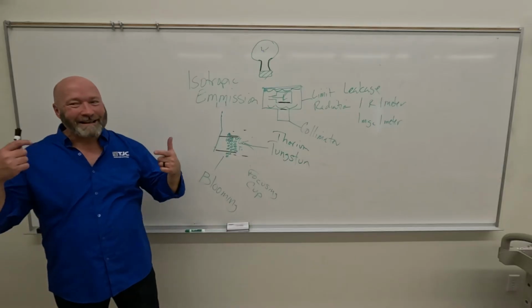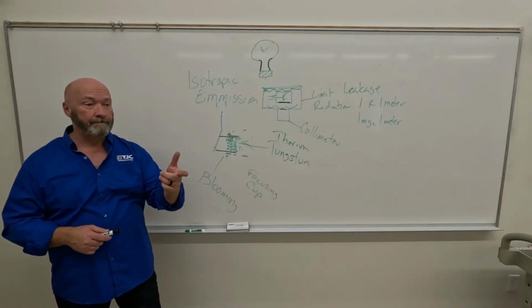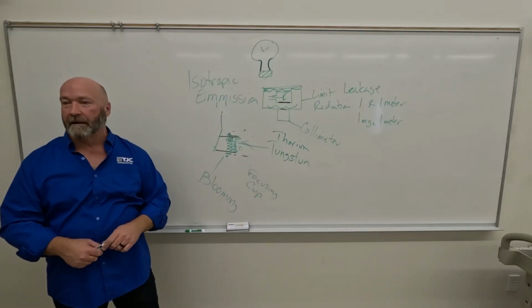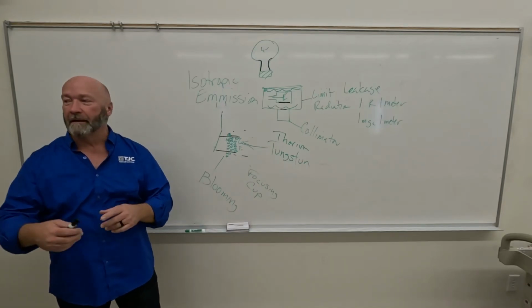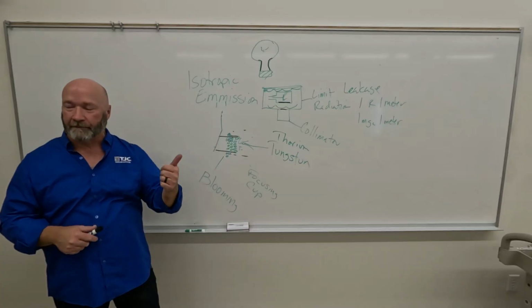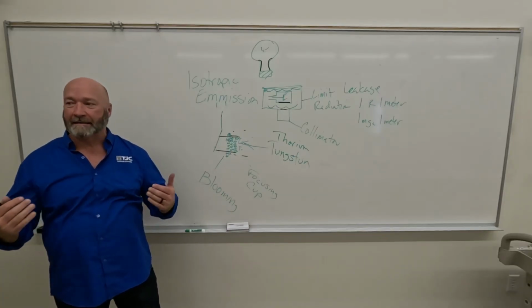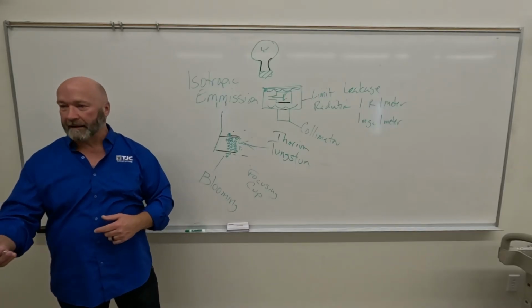Okay, so what does that sound a little bit like? What's that? Filter. Yeah, it's filtration. It's a type of filtration. It's what we call added, increased inherent filtration. We have two different types of filtration. We have added filtration. We have inherent filtration. Inherent filtration is what we can't take away from the imaging system and still legally make an x-ray.